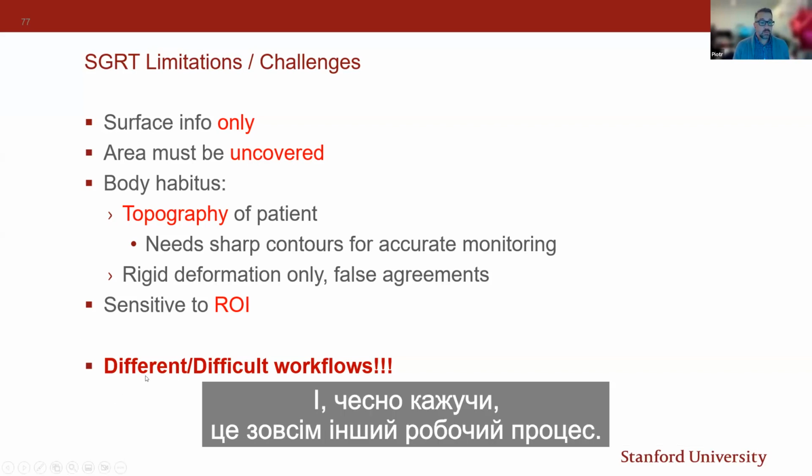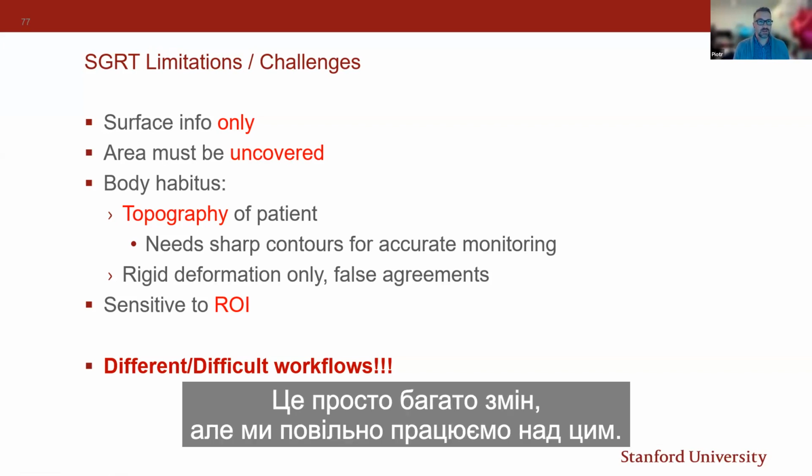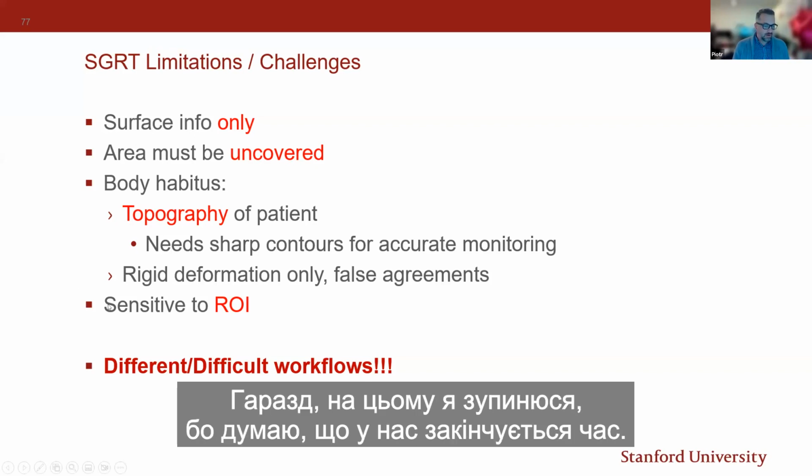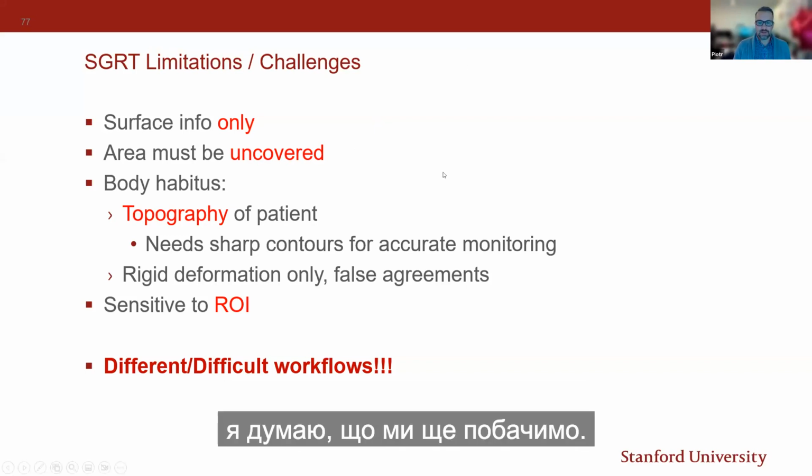And to be honest, it's quite a different workflow. That's why I think for us, there's a pretty slow adaptation of SGRT. It's just a lot of changes, but we're slowly working through them. Okay, I'm going to stop here because I think we're going to run out of time. So maybe if there are some questions.